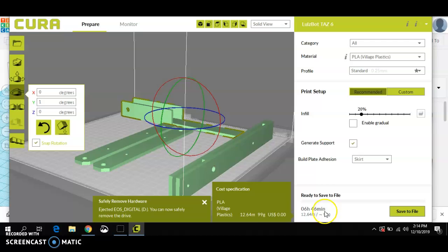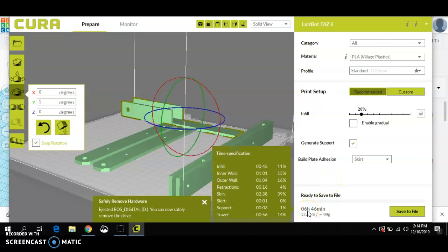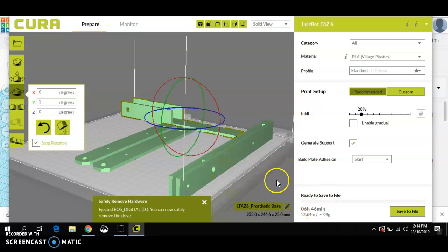Before we end here, I just want to point out some other information available in Cura. It estimates this print is going to take about 6 hours and 46 minutes. It's going to take about 12 meters of material and 99 grams of PLA. PLA costs about 1 cent per gram, so just to put that into perspective, this is about a $1 print. It's already saved. We're ready to move that over to the printer.